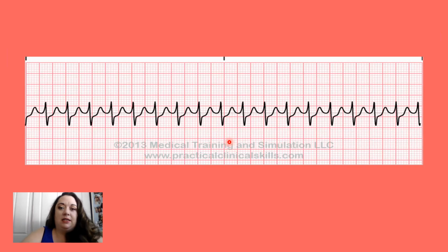Your patient feels super weird when it happens. I've heard them say they get a sense of impending doom. They have chest pain. They can't breathe. Feels like their chest is caving in. Bunch of weird sensations. We're not going to tell them, hey, this is going to stop your heart for a second, but you'll be fine. We're just going to take precautions.